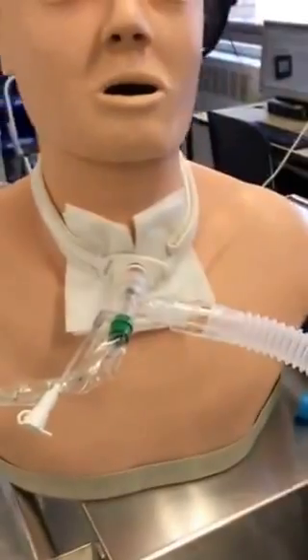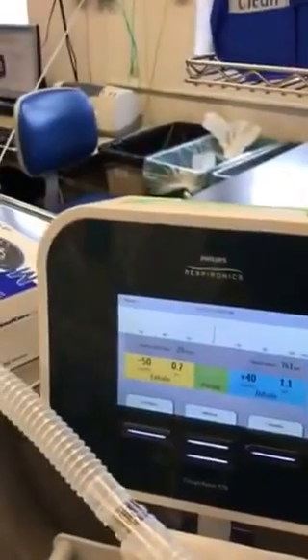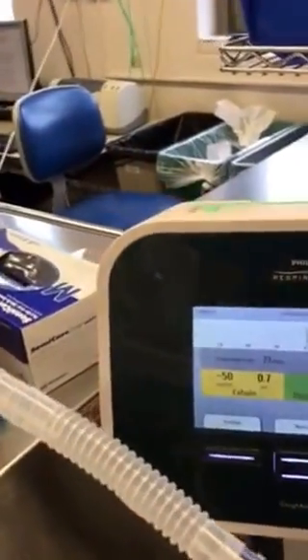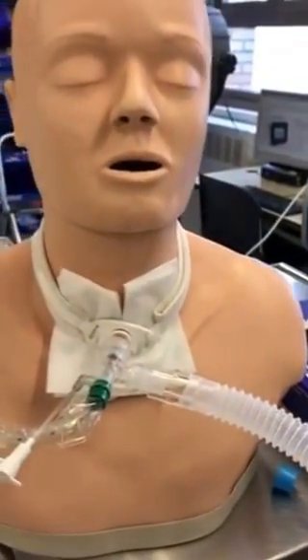To start it up, you want to make sure your suction's all ready. We're assuming that we have suction attached to the wall. Let your patient know what you're doing, even if it's not their first time.